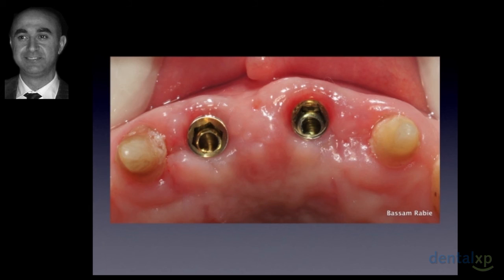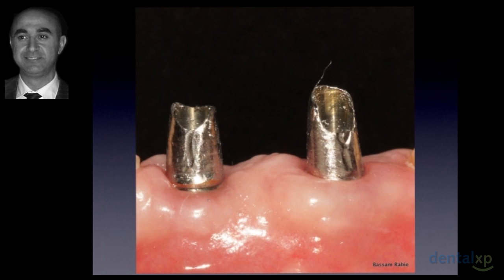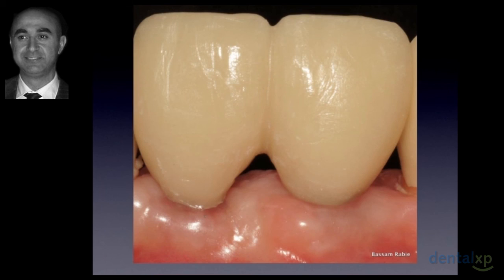Now, after almost 4 weeks of healing and removal of the sutures, you can see the amount of keratinized tissue labial and in between the implants and in between the natural tooth and the implant itself. You might find on the left side of your screen, at the implant, there is some kind of recession, maybe 0.5 millimeters, but not to the level of the microchannels of the Laser-Lok. And then placing the prepared abutments and CAD-CAM temporary crowns splinted together just for healing.